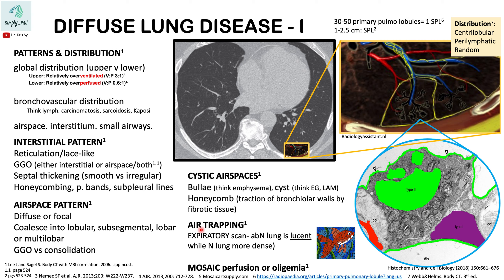Air trapping is a finding where the abnormal lung appears more lucent while the normal lung is more dense. Air trapping can be seen on inspiratory scans but is more accentuated on expiratory scans. Another pattern is mosaic perfusion or oligemia, which we will discuss shortly.